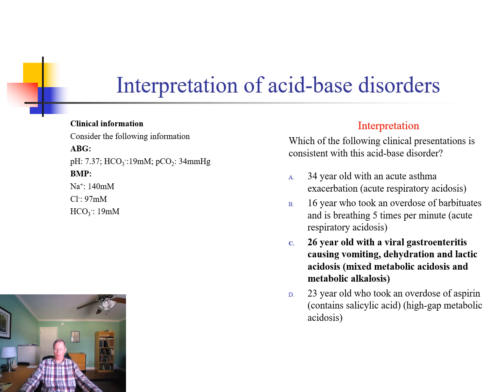A 34-year-old with an acute asthma exacerbation would be consistent with an acute respiratory acidosis. Same thing for a person who was hypoventilating after taking barbiturates. And the salicylate would cause a high anion gap metabolic acidosis, but not anything mixed.